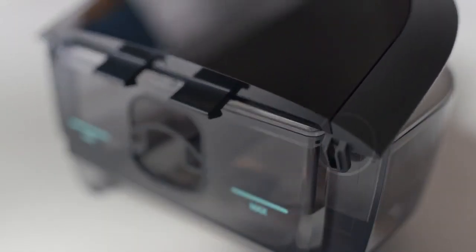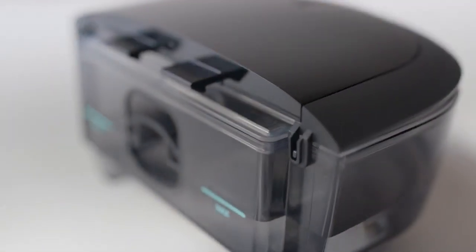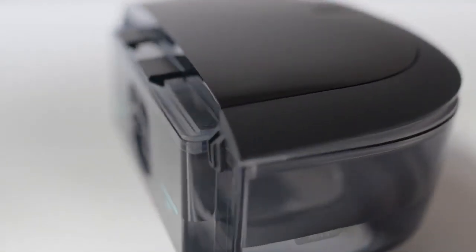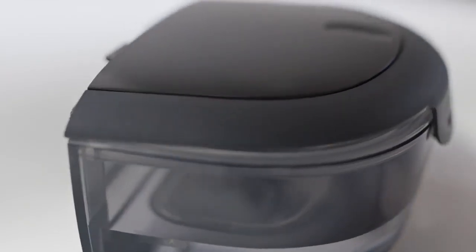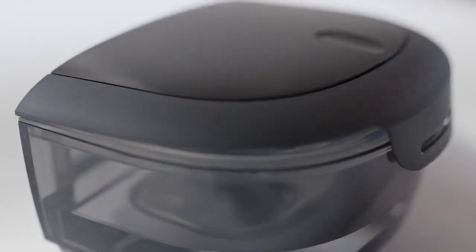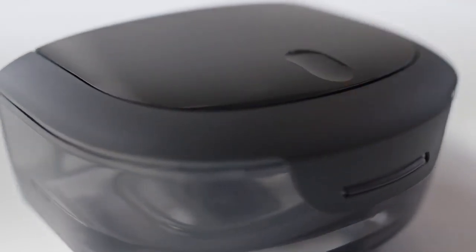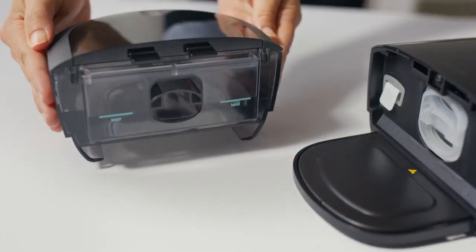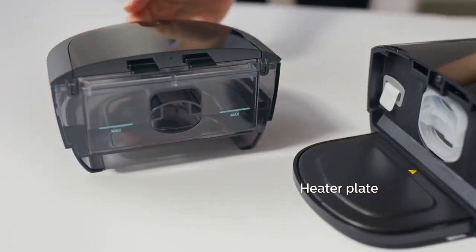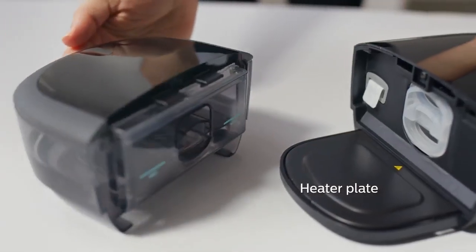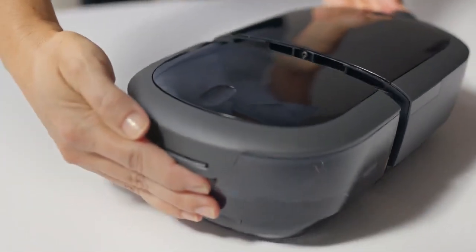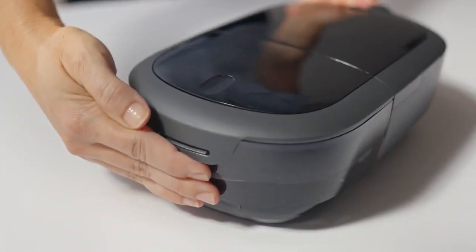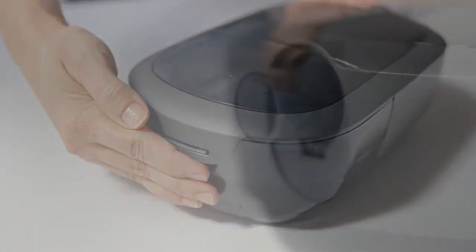To reassemble, position the hooks on the lid over the small tabs on the tank and snap the lid securely closed. Place the water tank on the table and align the bottom lip of the tank with the heater plate. Slide the tank onto the device until it clicks and locks into place.